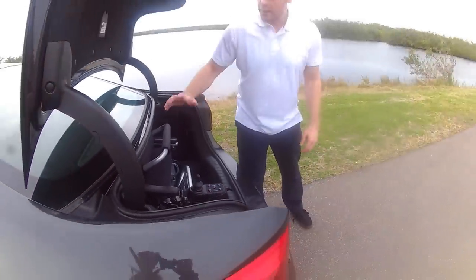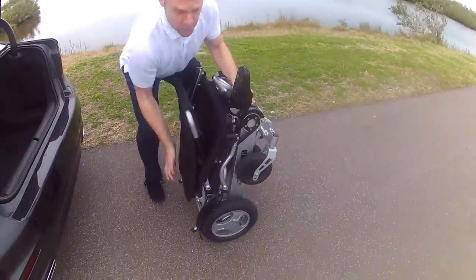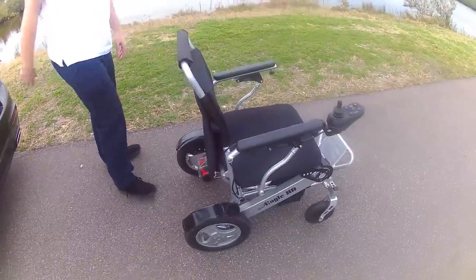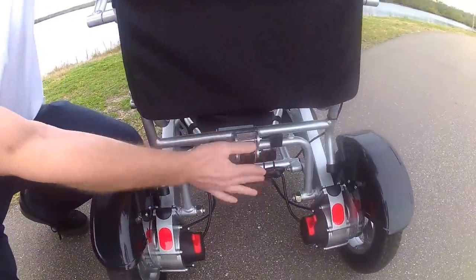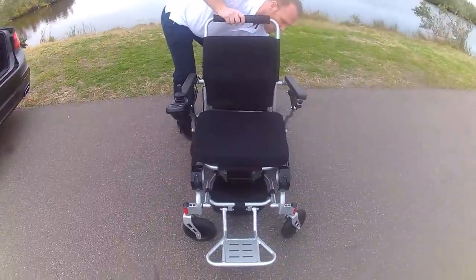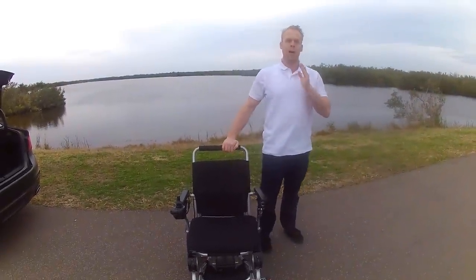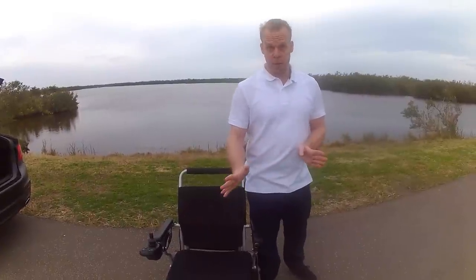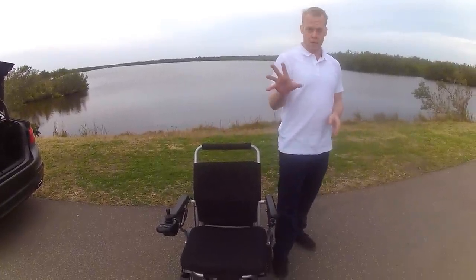Hello, my name is Paul from Quick and Mobile and we are here at the Canaveral National Seashore. I'm going to be demonstrating the Eagle Folding Power Wheelchair, because we get a lot of questions about it. You'll have to forgive the cars driving by, because we are at a national park — and one of the reasons people get the Eagle is because they can get out and do things like this.